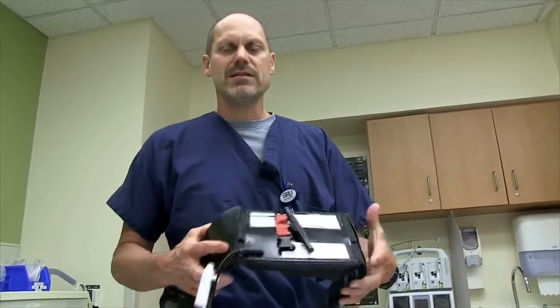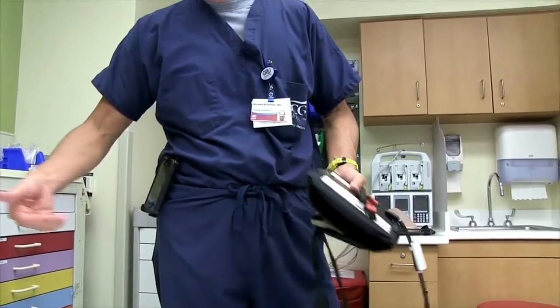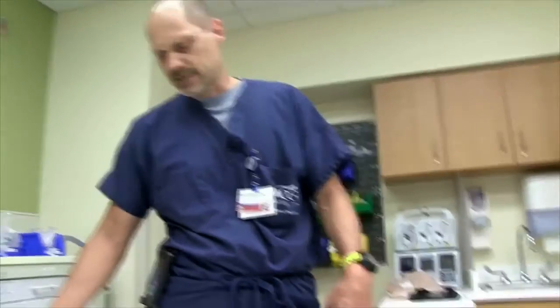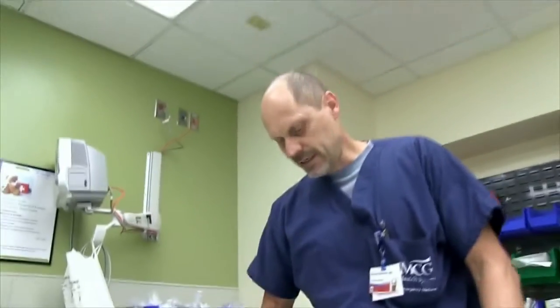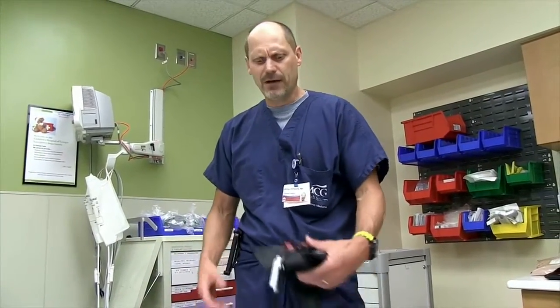Dr. Crouchhorn is a part-time faculty with us at Georgia Regents University. The idea originally was to be able to stop injuries that occur in the groin at the junction where body armor ends and the extremities come off. What we were seeing in combat is injuries from ballistic missiles — either bullets or blast injuries — extending through very proximal femoral arteries into the iliac arteries, and the soldiers were bleeding to death on the battlefield.